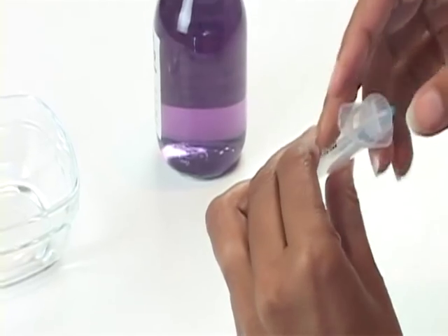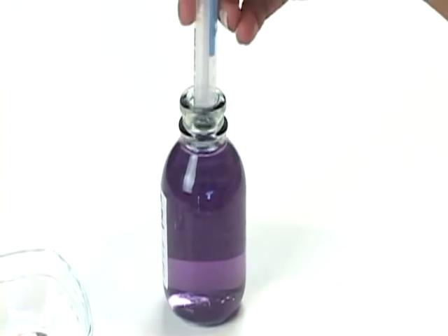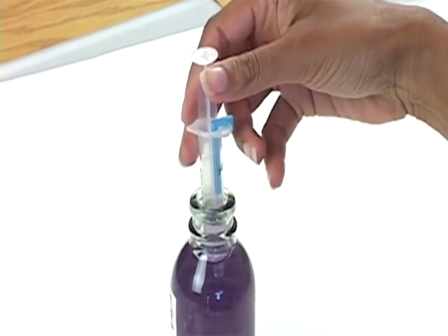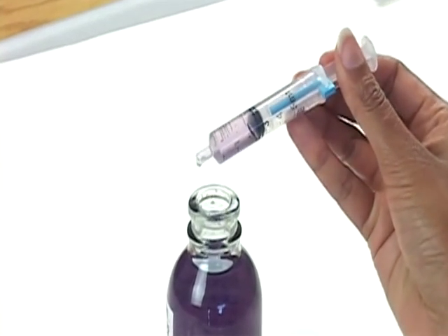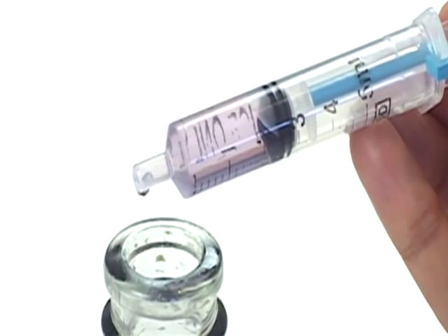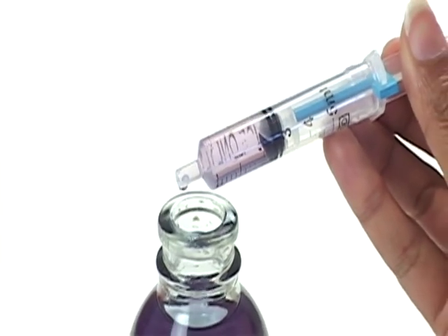Withdraw medicine into the syringe as you normally would. When the piston touches the syringe clip, it will automatically stop it, thus determining an exact dosage. In this case, you see there is 2.5 ml of medicine withdrawn.